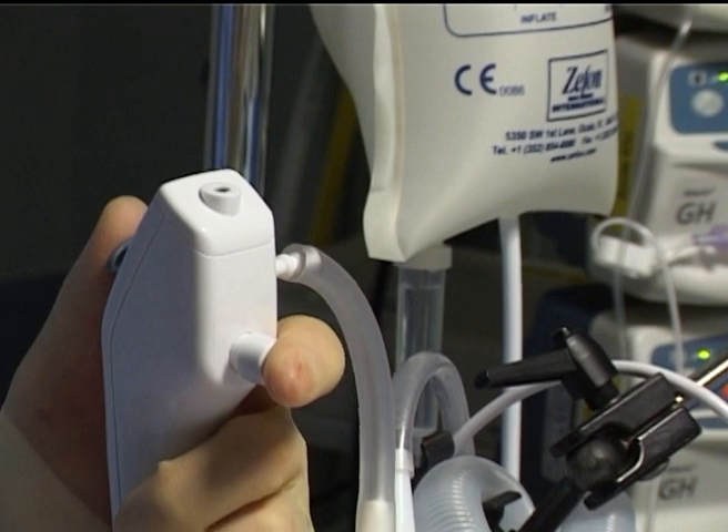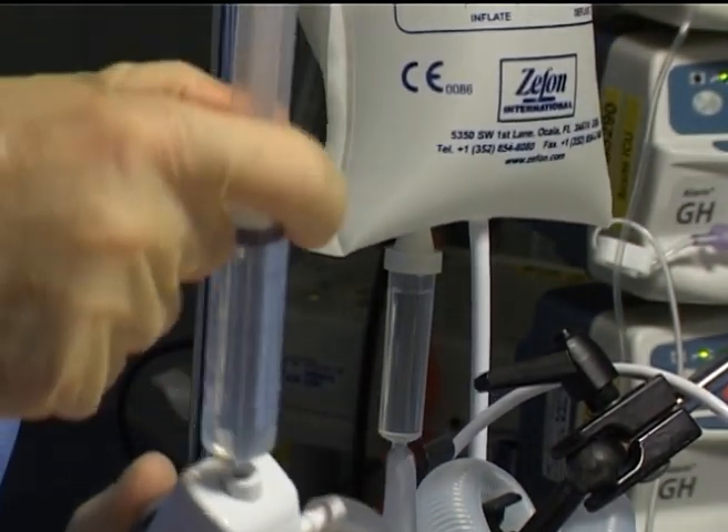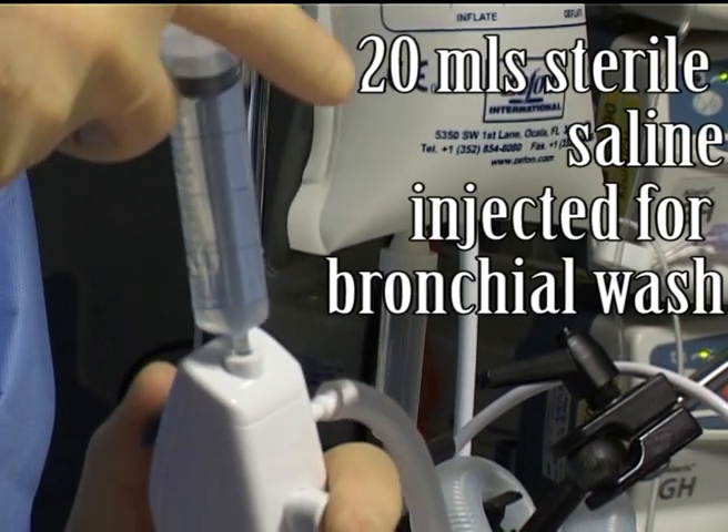We can use 20ml aliquots of sterile saline to try and dislodge this mucus plugging. The saline is drawn up and inserted into the bronchoscope, then flushed through the working channel.